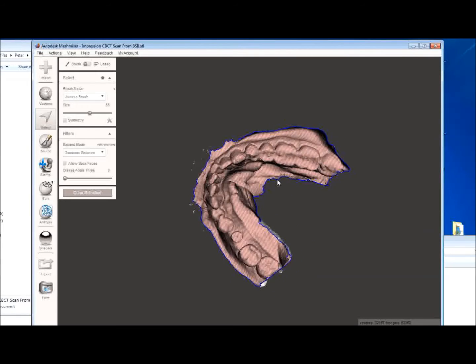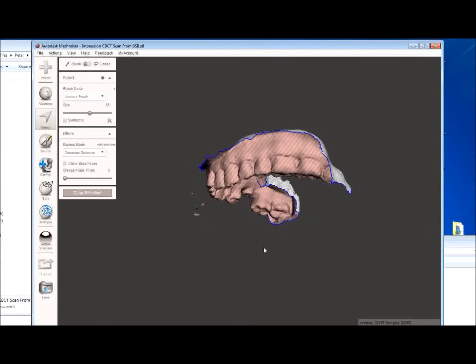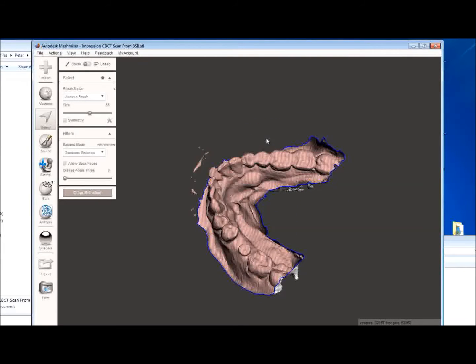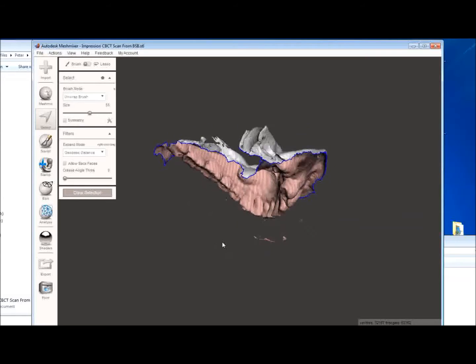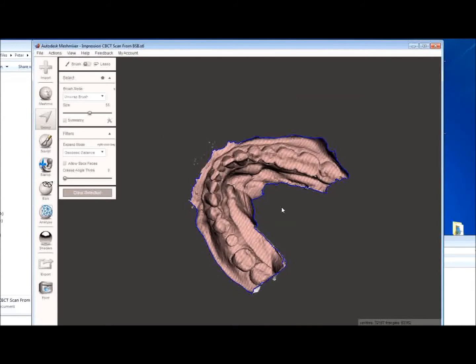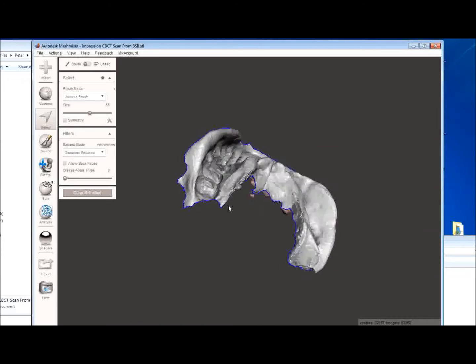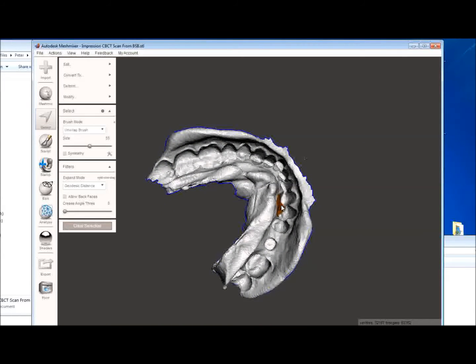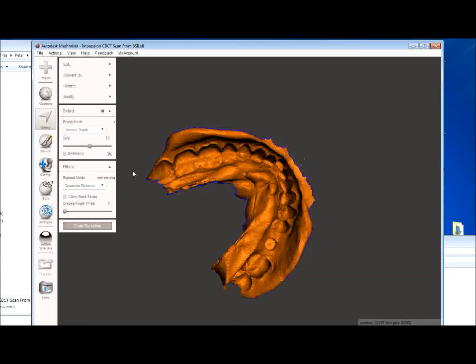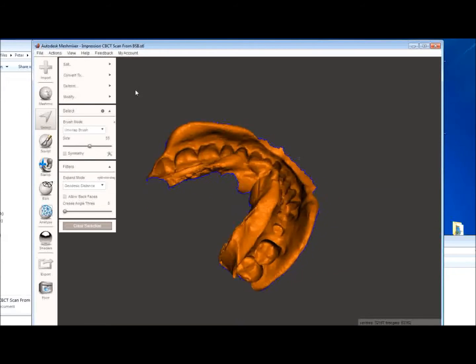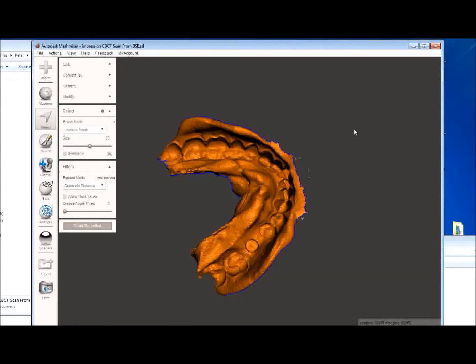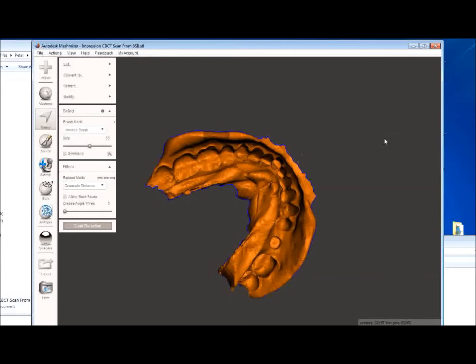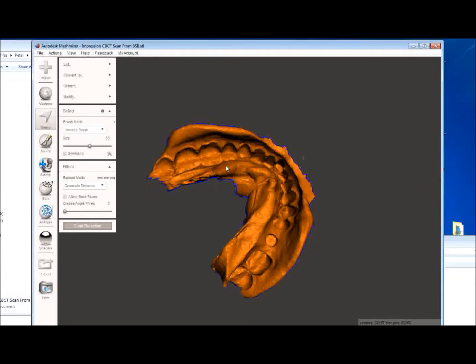And what it's going to do is remove that shell of the tray and expose the underlying impression. Now this image isn't reversed as yet. You can see the pink striped area, the software still thinks that's the inside of the impression or the model. So what we'll need to do is reverse this, turn this around. Double click to select the entire area. Which now, again the software thinks this is the outside of the STL file.